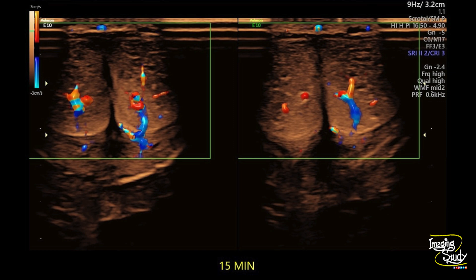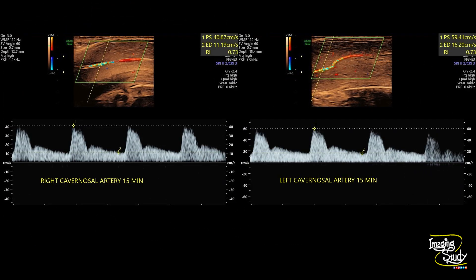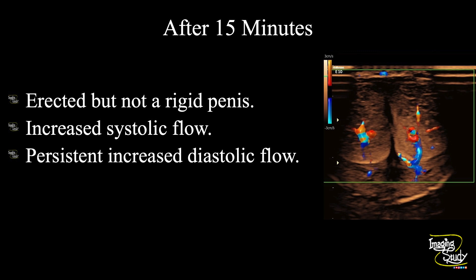Now let's check after 15 minutes. The prominent cavernosal arteries are still visible with a similar diameter to before, but systolic and diastolic velocities have increased further. The peak systolic velocities have now crossed 30 cm/s, so we can say there is no arteriogenic cause of erectile dysfunction. What we now need to see is a reduction in diastolic flow to consider this patient normal. After 15 minutes the penis is still erected but not rigid, with increased systolic flow and persistently elevated diastolic flow.